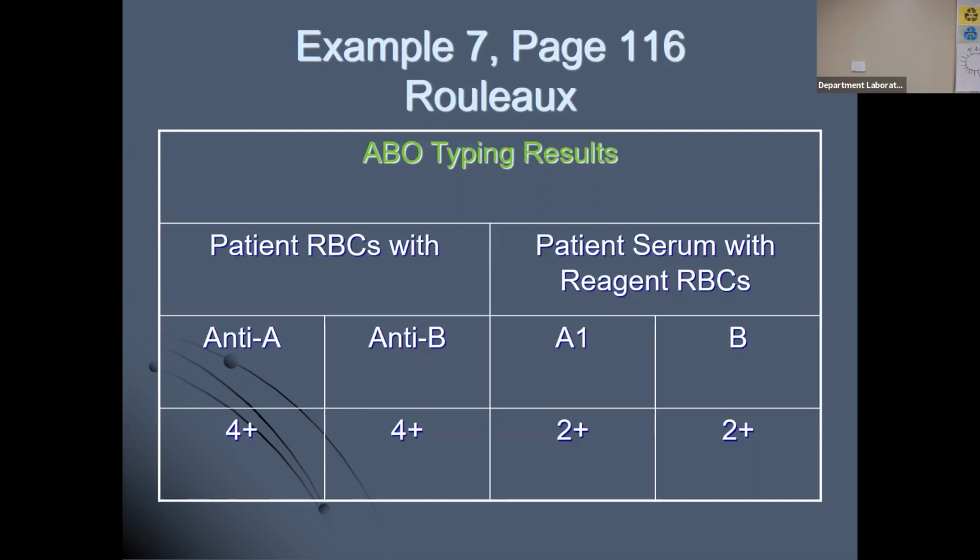If you think about Rouleau, there's a test in blood bank that we can do. It's called the saline replacement. You will take these two tubes, spin them down, and remove patient plasma. If the antibody is there, it's already bound to the cells, right? You can remove patient plasma, add 2 drops of saline, recentrifuge, and then read for agglutination. The Rouleau should dissipate, but your true agglutination, the antigen-antibody complex, should still be there. That's called saline replacement. So in this example, if we do the saline replacement and repeat our testing, these 2 tubes should both go negative.